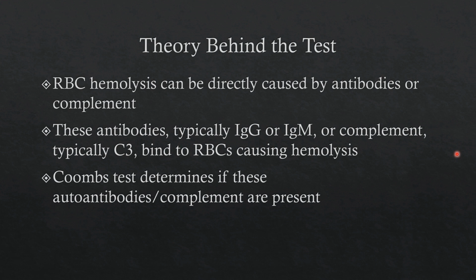The antibodies, which are usually IgG or IgM, and when it comes to complement, it's usually C3, will directly bind to these red blood cells, causing the hemolysis. And so the Coombs test is what you would use to determine if these antibodies or complement are present on the RBCs or in the serum and can potentially cause a hemolytic anemia.